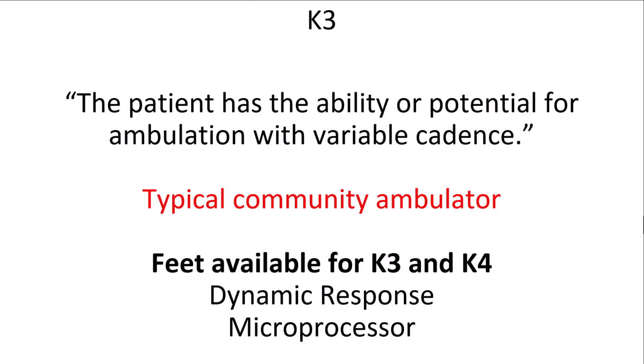Now I'd like to move on to feet available for K3 ambulator. And remember, this is a typical community ambulator. There are different kinds of feet available for both K3 and K4, and these are the dynamic response foot as well as the microprocessor foot.